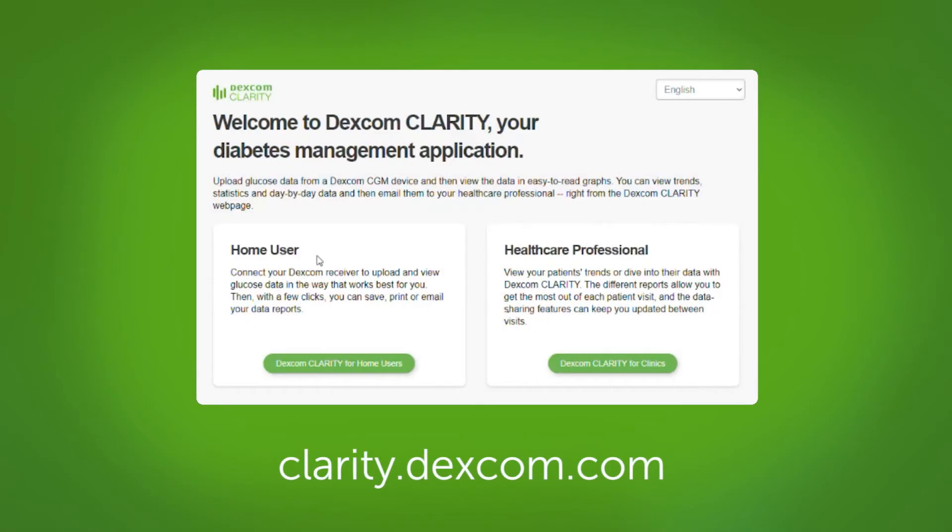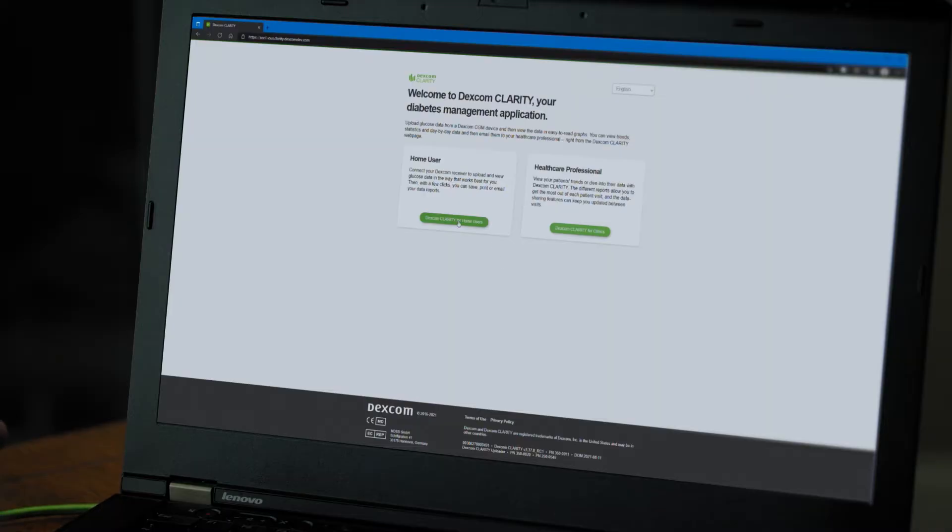First, go to the website clarity.dexcom.com and click Dexcom Clarity for Home Users.